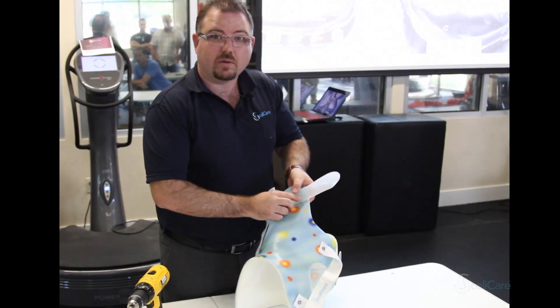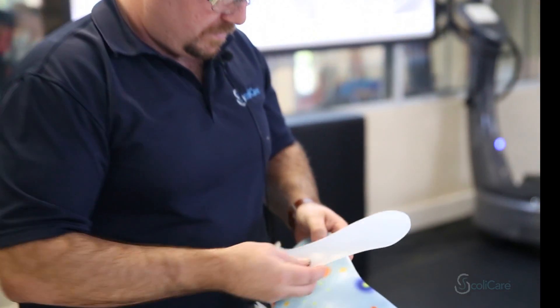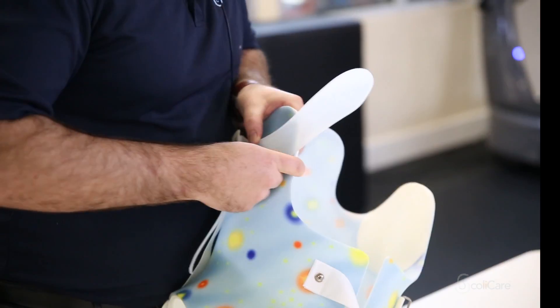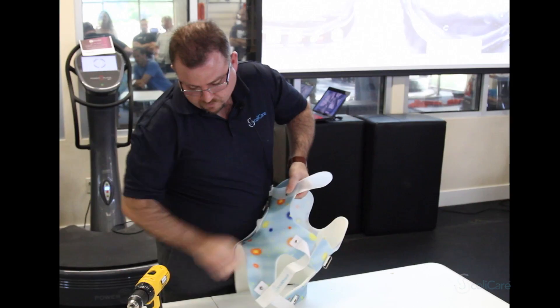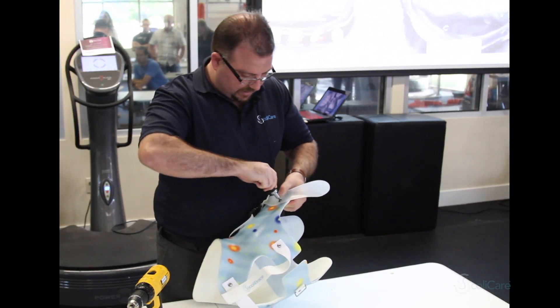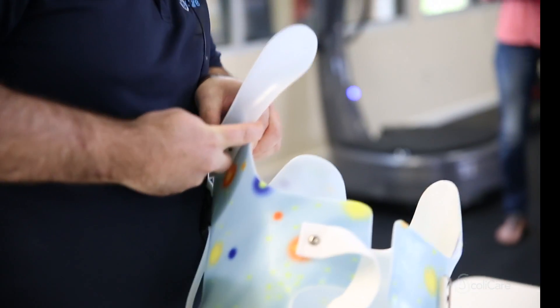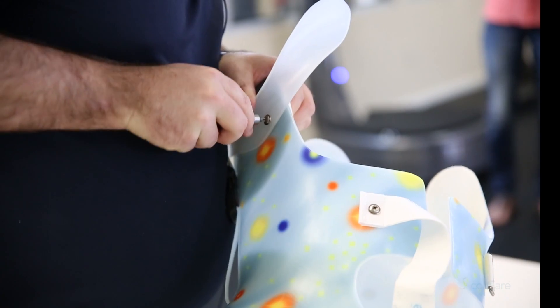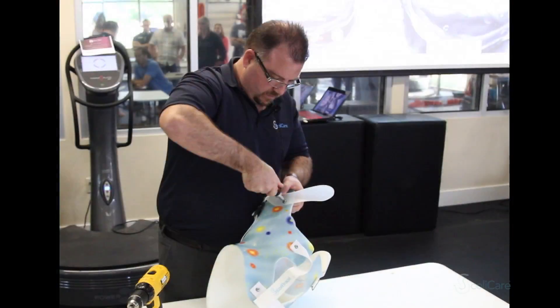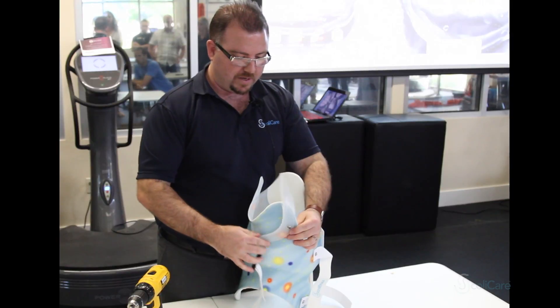From here we simply line up the hole on the kyphosis brace arm and we connect it up. At this point it's usually easier to use a little hand screwdriver just so that we can get the pressure on there to do the screw up. We don't want to tighten it up all the way because what we actually want is for this part of the arm to be able to pivot.